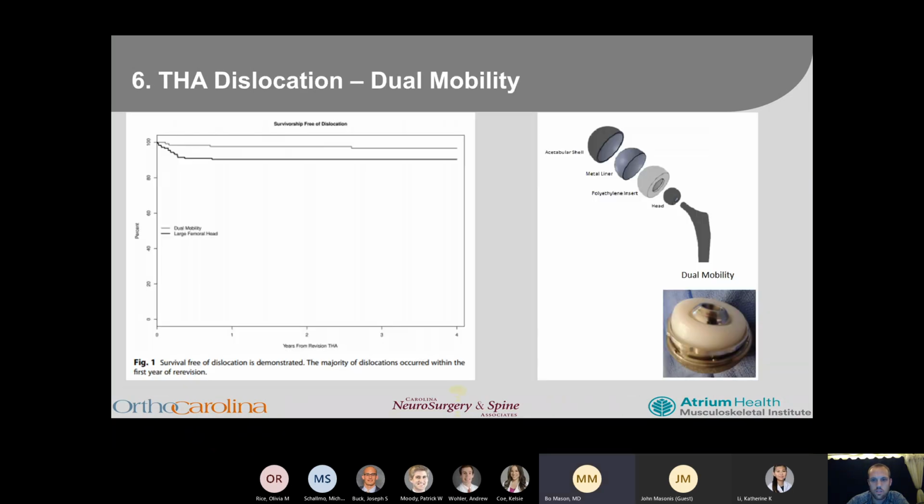They have tested on that in the past, and they will test also on your ability to recognize an intraprosthetic dislocation. So be aware if you see a dual mobility and then you see it dislocate, it looks a little bit funny, shifted just a little bit, look for that as a potential answer.